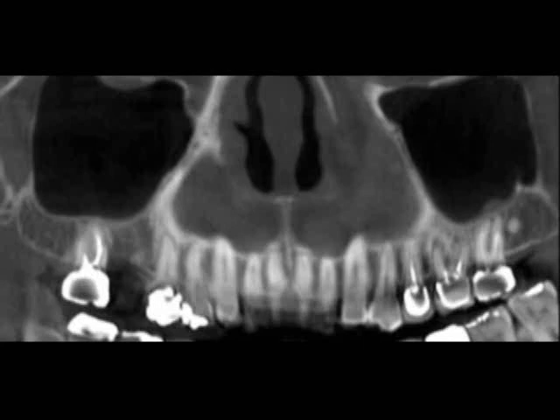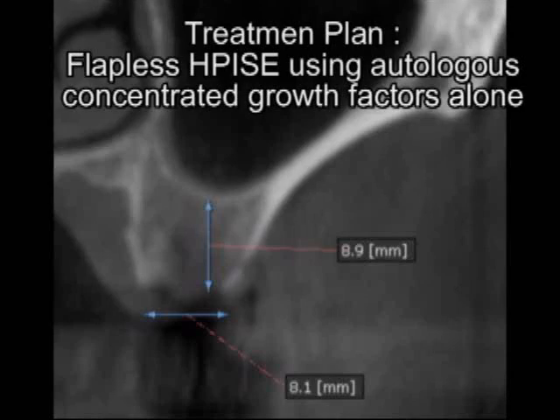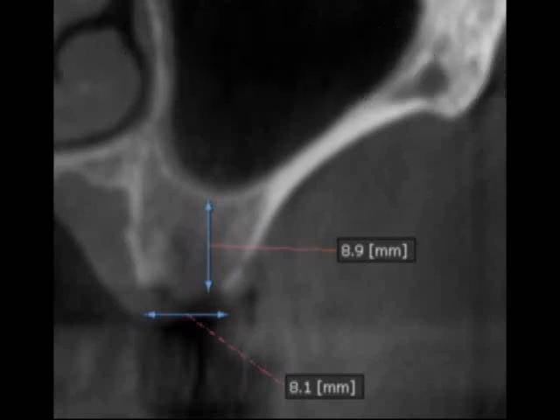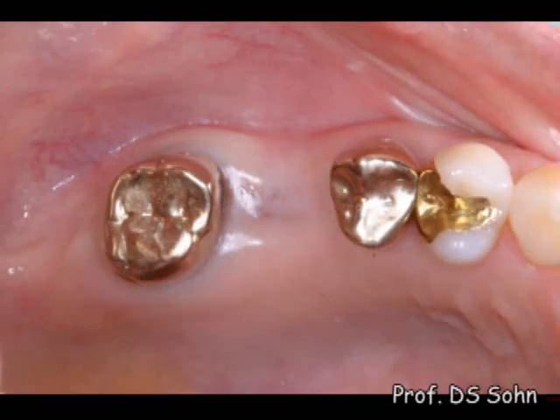The panoramic view of cone-beam CT shows no pathology in the right maxillary sinus. The cross-sectional view at the site of the missing first molar shows approximately 9mm bone height and 8mm bone width. A flapless HPISE technique using autologous concentrated growth factors was planned in order to minimize postoperative patient discomfort.